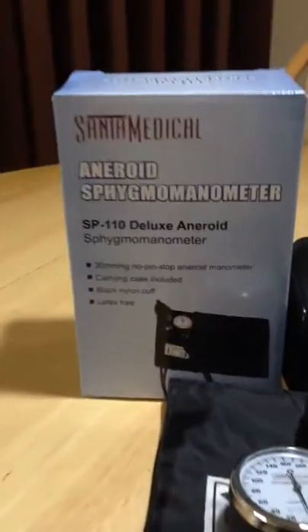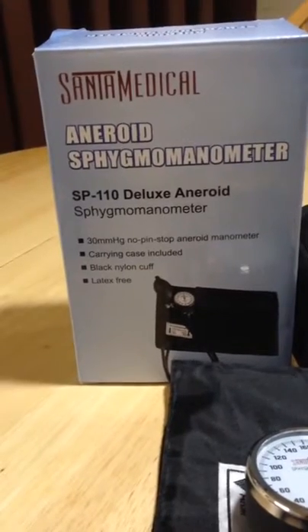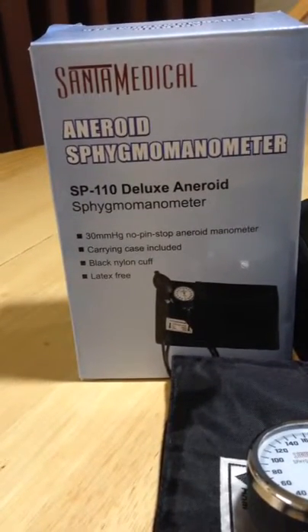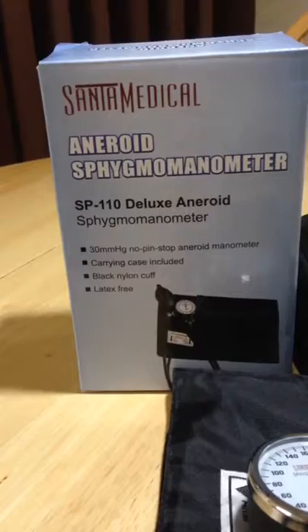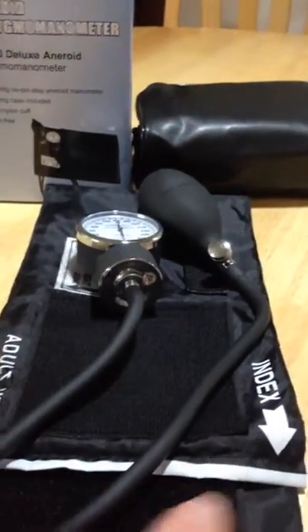Here's the box for Santa Medical. It's an aneroid — like a manometer — and it's the SP110 Deluxe. It's up to 300 millimeters of pressure, no pin stop, carrying case included. It's a black nylon cuff and it is latex free, which is awesome. On the cuff itself it comes with the index range markings.